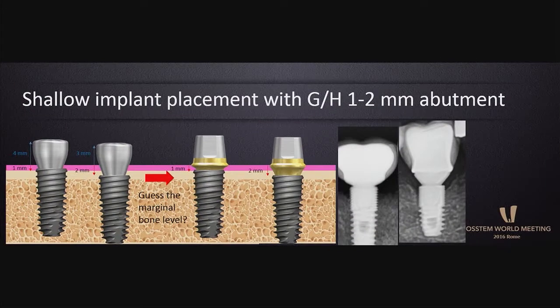What happens when we have a shallow placed implant? This implant is placed about 1 to 2 millimeters below the gingival margin. Can you guess where the marginal bone level will be? As you know from the biologic width, the bone will set back for natural protection, and it would lead to crestal bone loss below the fixture platform level. The radiograph shows that these two implants have bone loss around the marginal bone level.